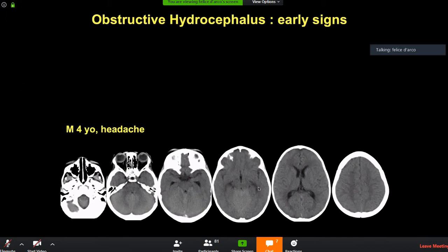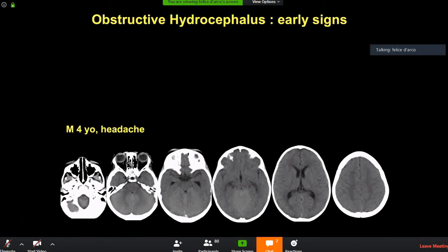Now look at this CT scan about hydrocephalus early signs — it was reported as negative. The child has only headaches and there is no enlargement of the lateral ventricle, so it seems fine. However, there are two problems: look at the shape of the temporal horns — this 90-degree shape is quite indicative of early hydrocephalus. Also, the third ventricle is bulging downwards, which you can miss if you only review axial slices.